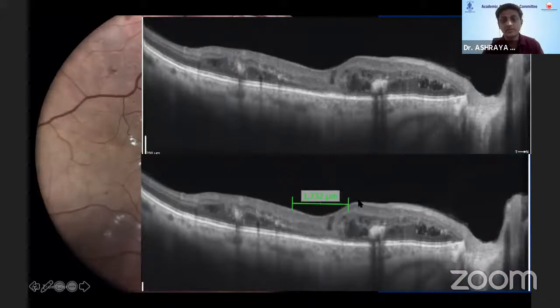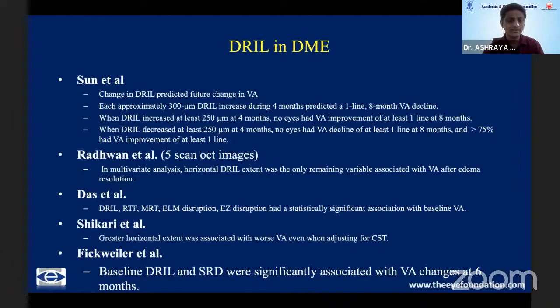This inter-observer variability has made it difficult for all the studies to have a correct dimension, because it can vary from OCT to OCT, from observer to observer, and from one OCT apparatus to another.